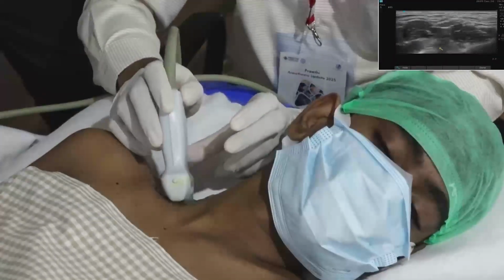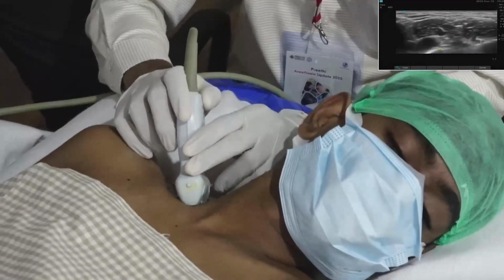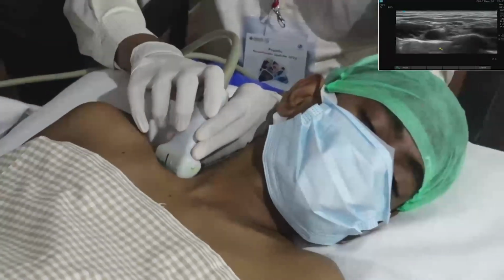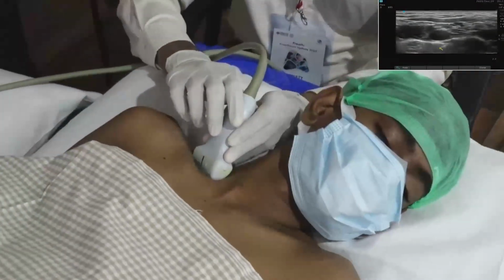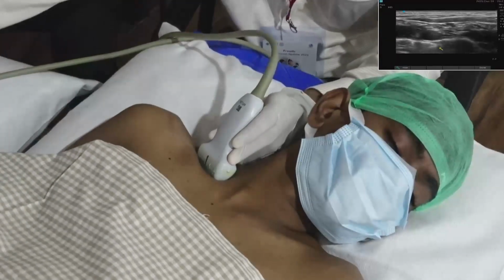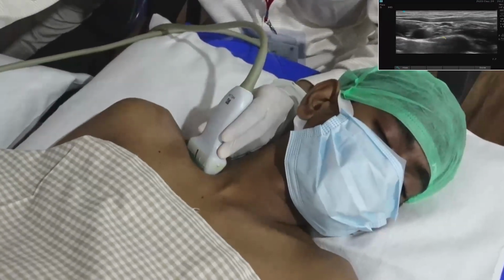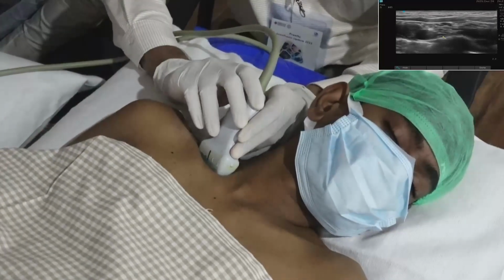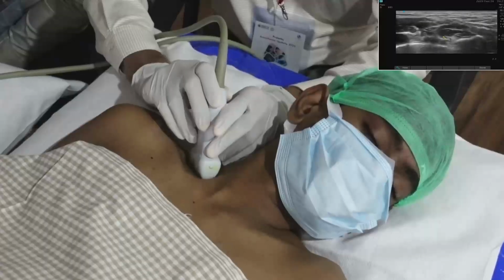Again, I will revise the anatomy once again and then move on to below the clavicle. So we know the elements of the brachial plexus are posterolateral to the artery. This is where we give the supraclavicular block, and I will move.